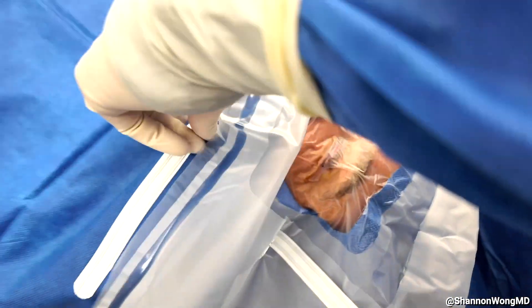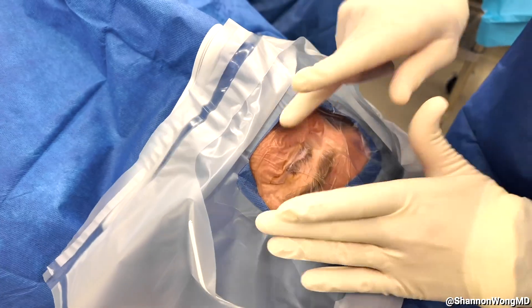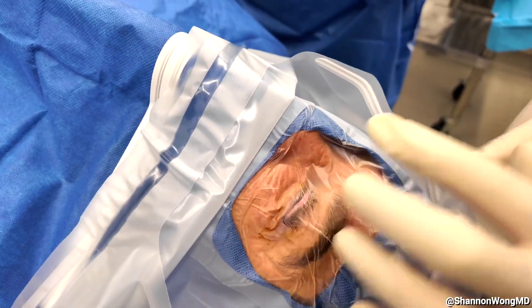Then we create a tent of air above the patient's chin and make sure that we have good contact of the adhesive around the patient's eyelids.